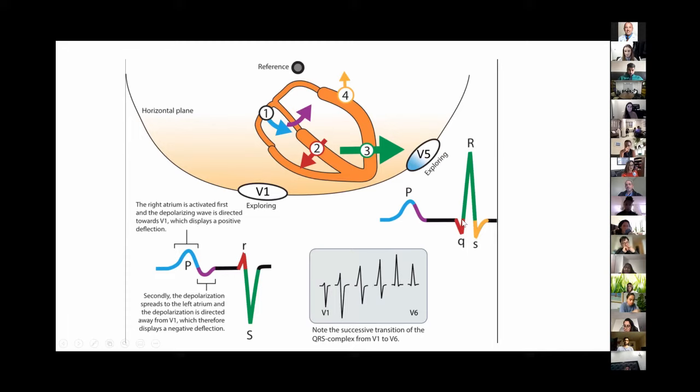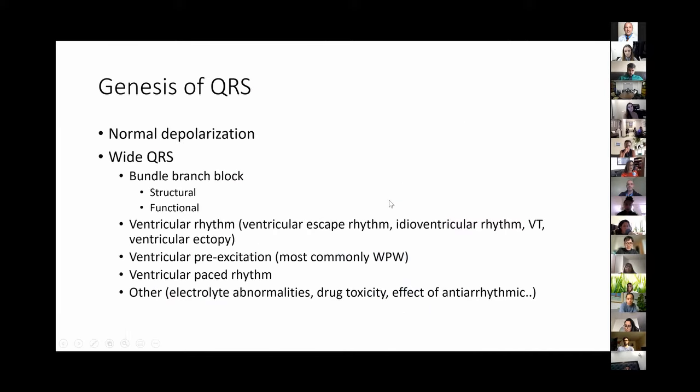Okay. So essentially, it's the same principle, because the signal is going towards or away from the lead. So that's your normal, right?